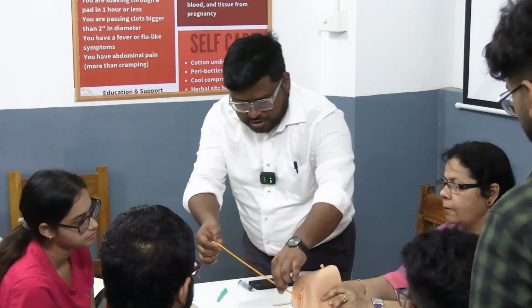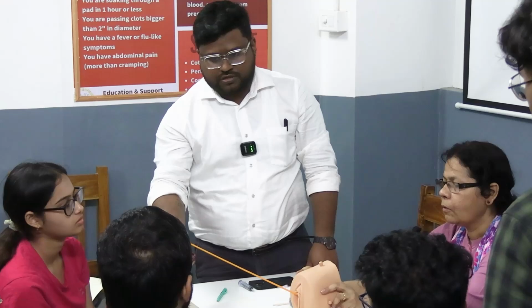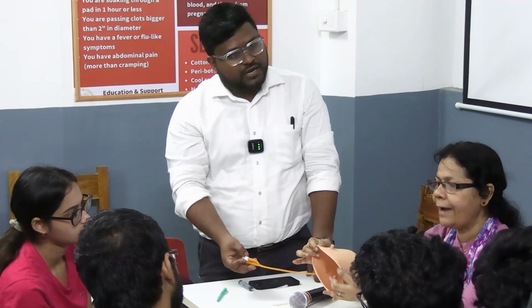See, now we pull it out. It's not coming out. Can you see? Why is it not coming out? Balloon. Where is the balloon stuck? Where is the balloon? In the bladder?